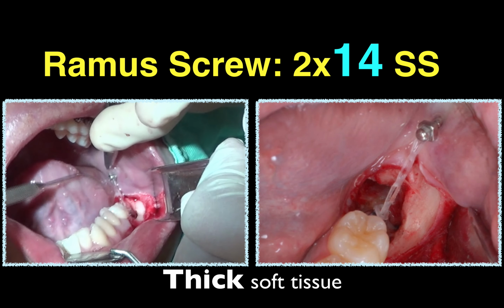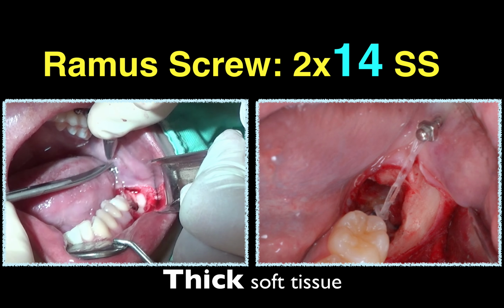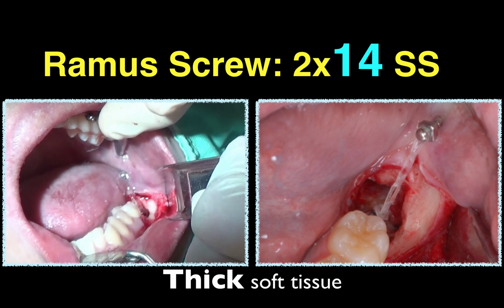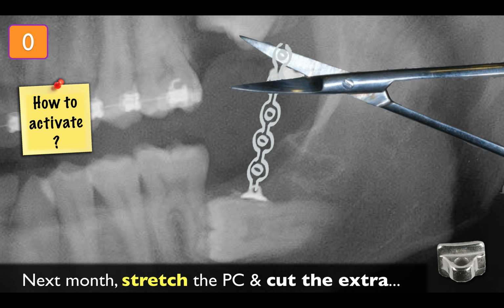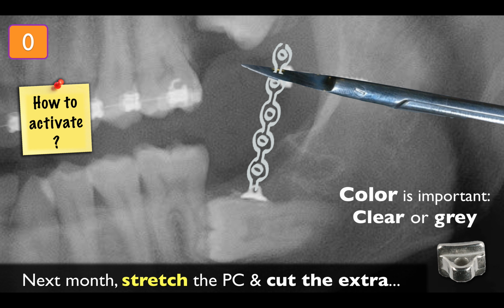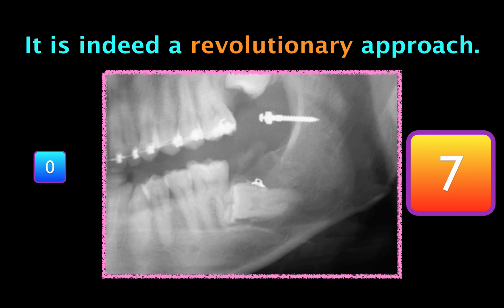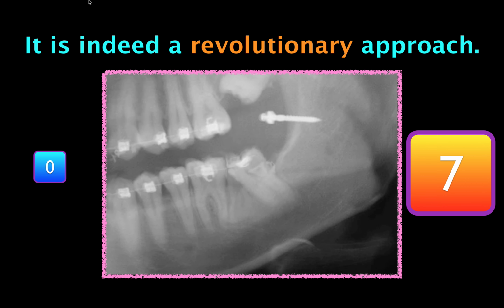Wow, just 20 seconds. And then you hook on this power chain and cut the extra. Next month, you stretch the power chain again and cut the extra again. That's it. So the second visit, probably just 10 seconds. Just 10 seconds, and they will erupt. Believe me, it's so easy. So look at 7 months. I think it's indeed a revolutionary approach.